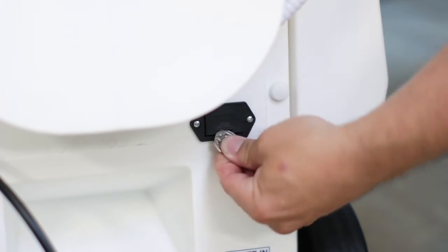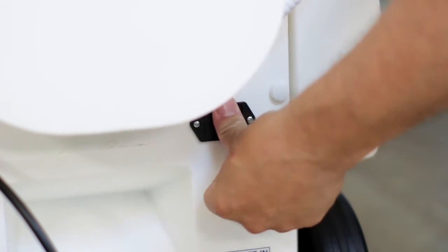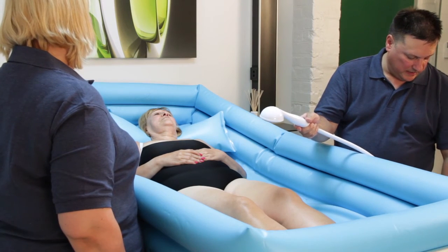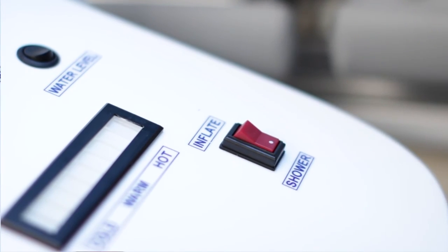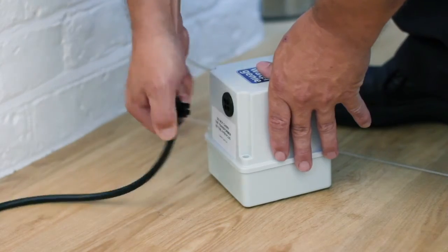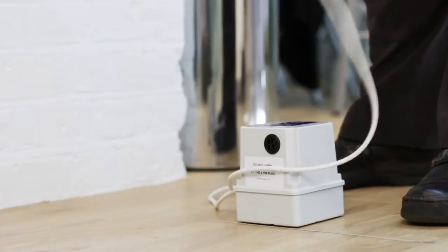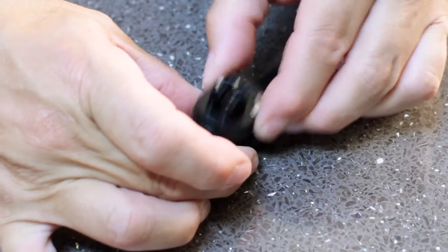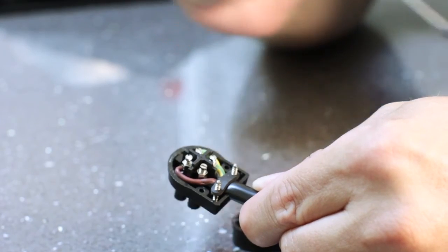If the water level sensor does not work, please check and replace the battery in the back of the unit. If the shower is filled and the lights are working but it won't shower, or you can't hear the pump, or there are no lights illuminating on the unit, please check the black plug that goes into the transformer. Simply turn off and unplug the unit from the wall, then unscrew the cover on the black plug and check that all the wires inside are properly connected, or replace the fuse.